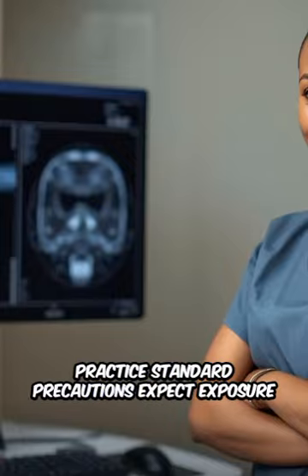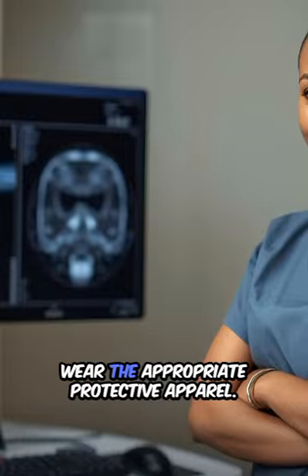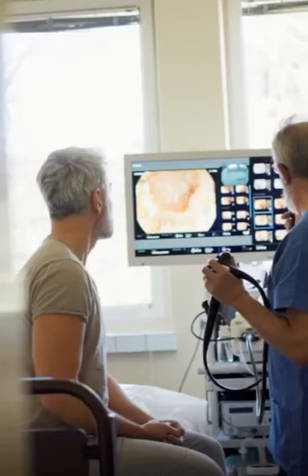Practice standard precautions. Expect exposure to blood and bodily fluids. Wear the appropriate protective apparel. Protect the IR and immobilization tools. Perform frequent hand hygiene. Clean equipment regularly.